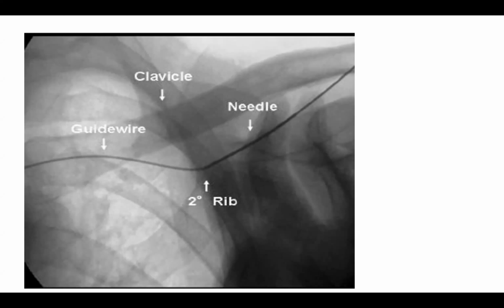In more than 95% of time, you will enter into the vein, and you will not have any problem of either a second or a third puncture of any kind if you have a very good knowledge of this procedure. So that is the key things. I've explained the key things about it.